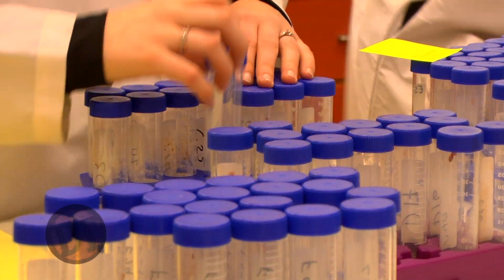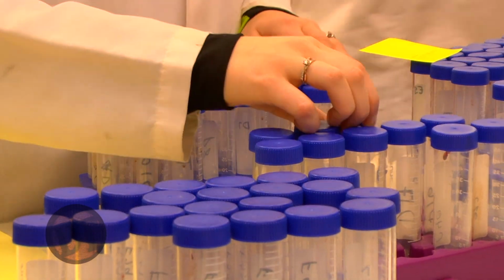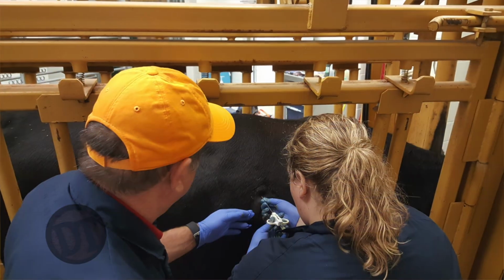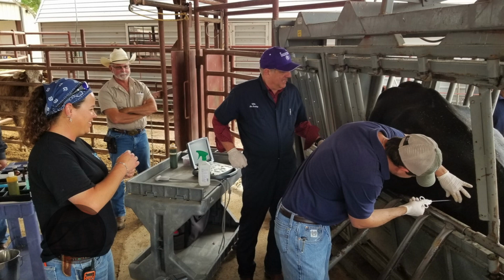We do a lot of work. We have the instrumentation in order to do the analysis, and nutritionally we saw a lot of issues that we felt like were related to mineral or vitamin nutrition. So the liver biopsy is one way that we can collect a very accurate sample, do an analysis on the liver, look for minerals, and it gives us exactly the status of the animal. It tells us exactly what your nutritional program is doing, and is a great tool, non-invasive, doesn't hurt the animals, and is a great sample that we can use.